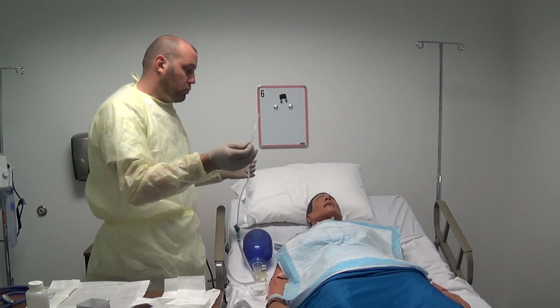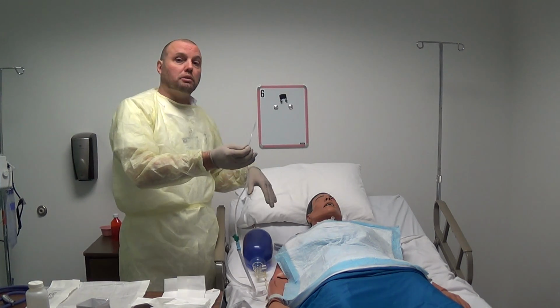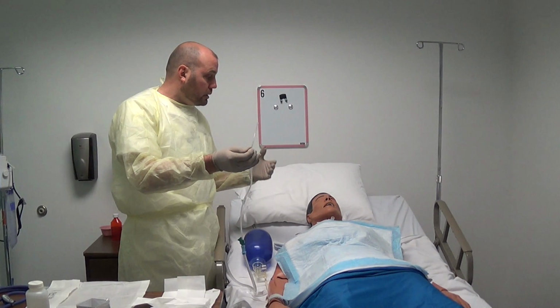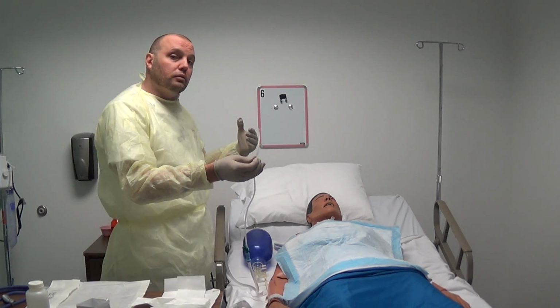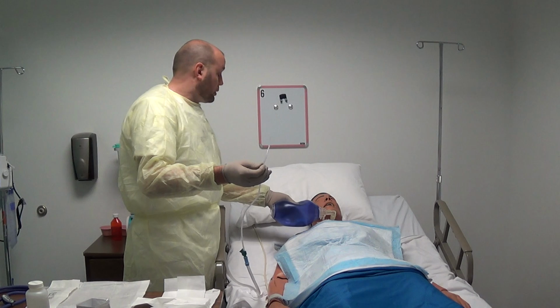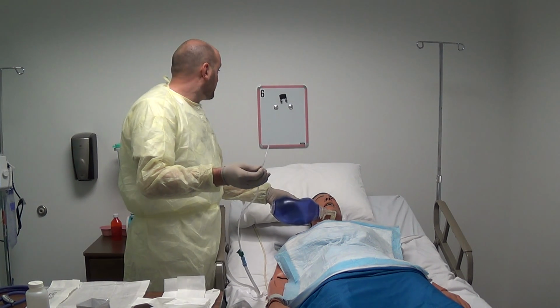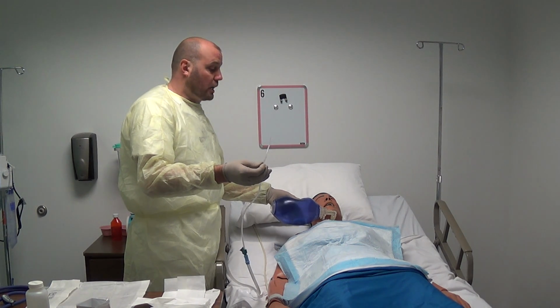Now, it's important to note that I should wait 1 minute between suctioning, and that's really to keep the patient from becoming hypoxic and giving them time to recover from a respiratory distress. Now, throughout this, though, his pulse oximetry is up to 94, floating to 95.